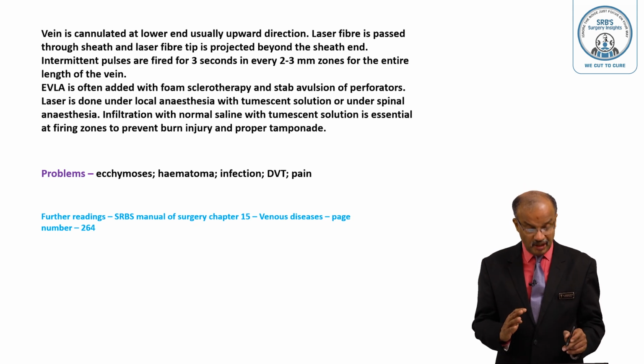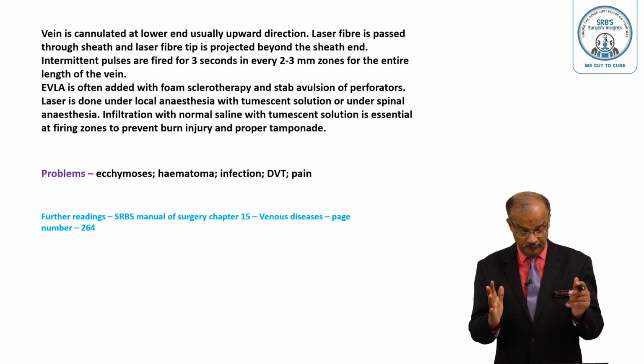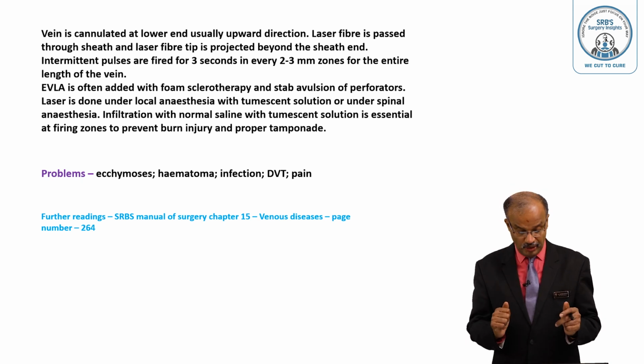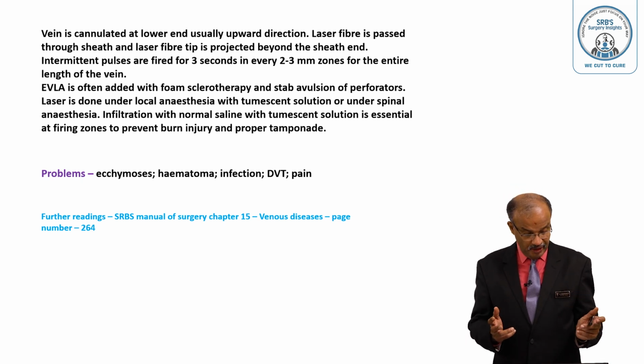So complications are ecchymosis, hematoma, bruising, infection. Because if you don't give tumescent anesthesia, it may cause problems. DVT can occur and pain.